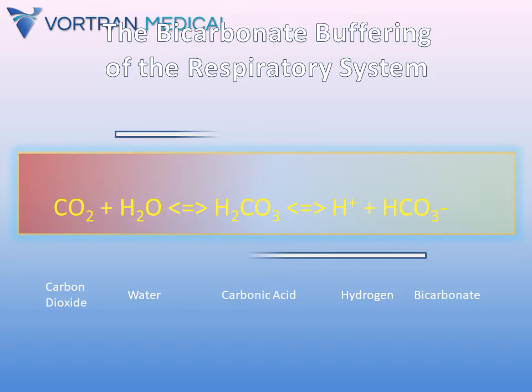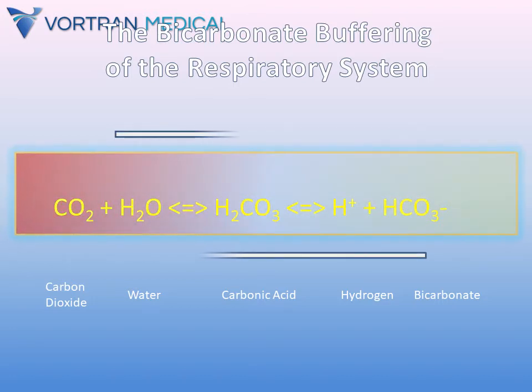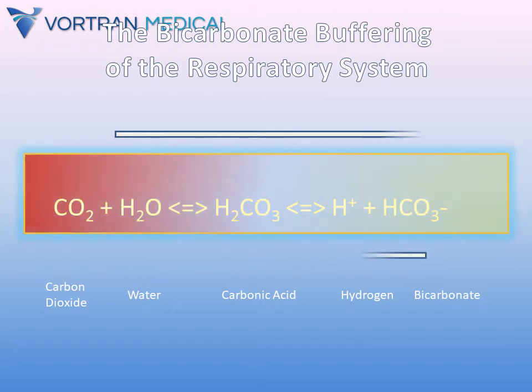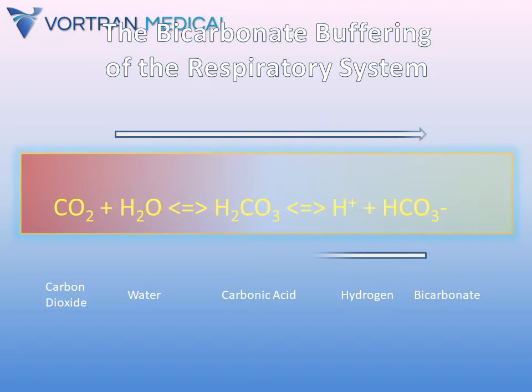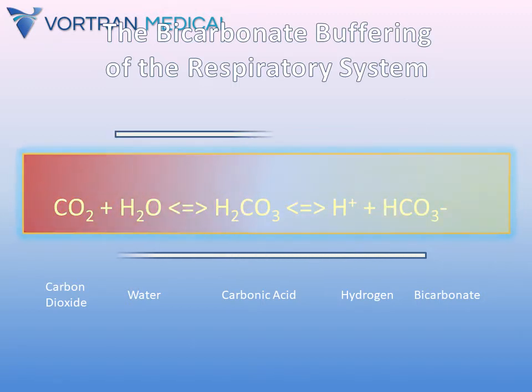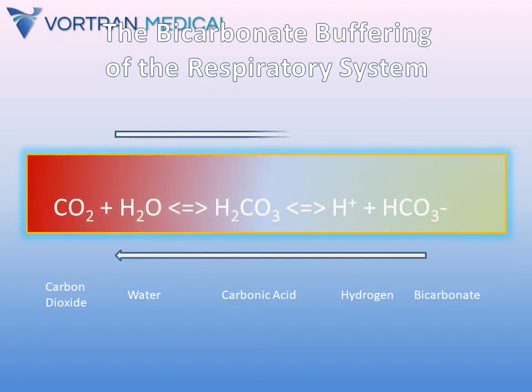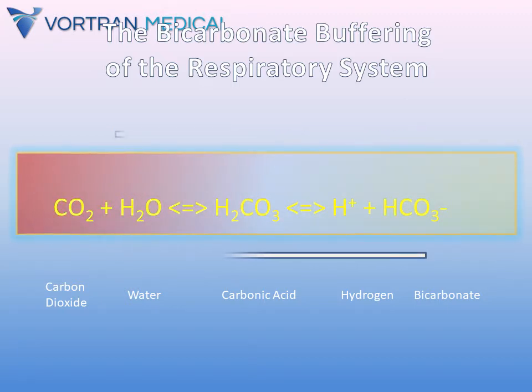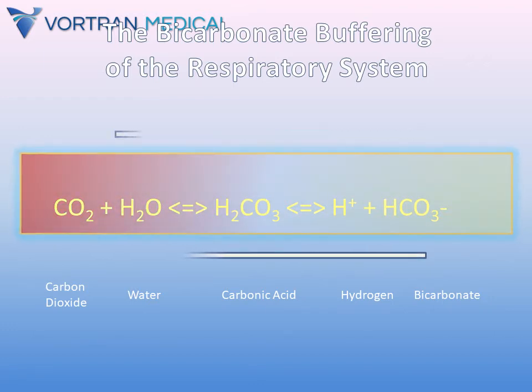You are in control of the oxygen and CO2 elimination you ventilate with, but you have no idea what the pH of the body is. However, the patient does. While ventilating, among other things, you are responsible to work with the body and provide a consistent value of oxygen and carbon dioxide, and given that, the body will be able to do its part in balancing the pH and maintaining homeostasis.